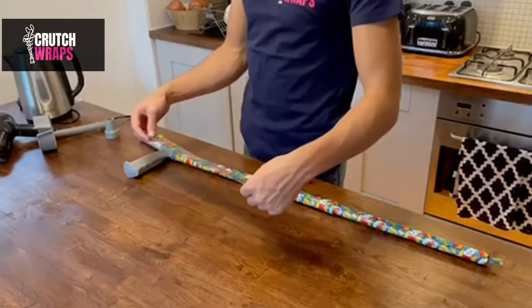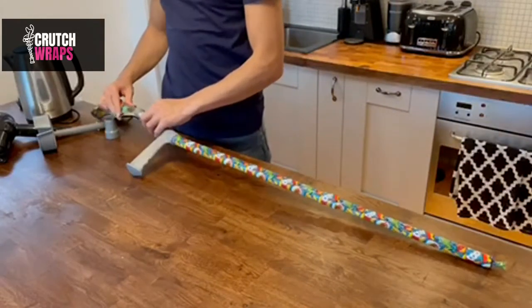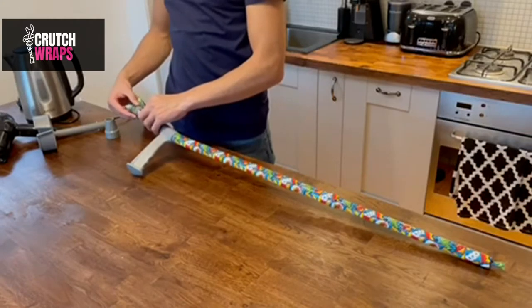Step 6. Take the last wrap and slide it over the top. Leave a finger space, then cut the excess off and save it for later. Use the hair dryer to shrink it on.